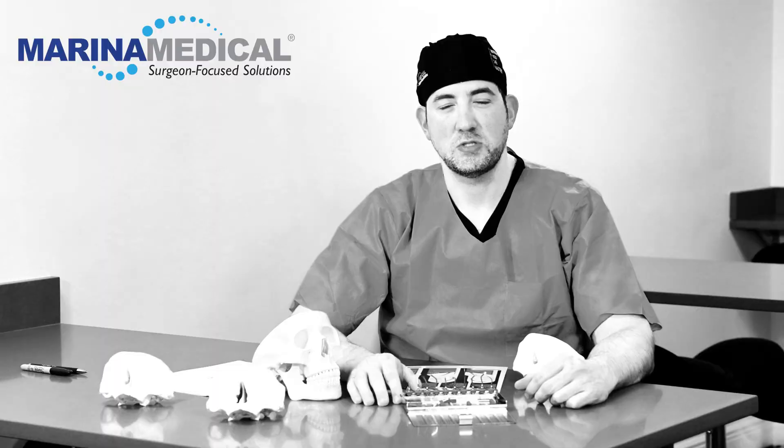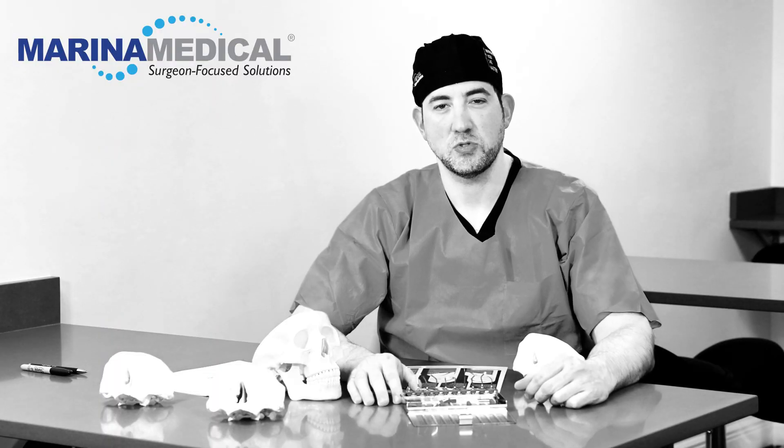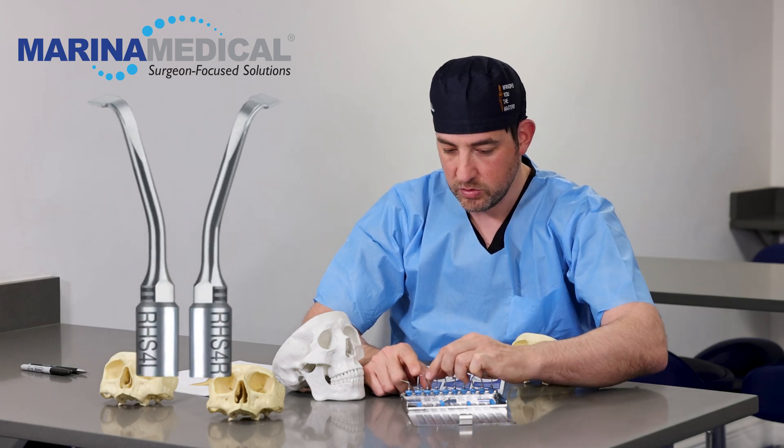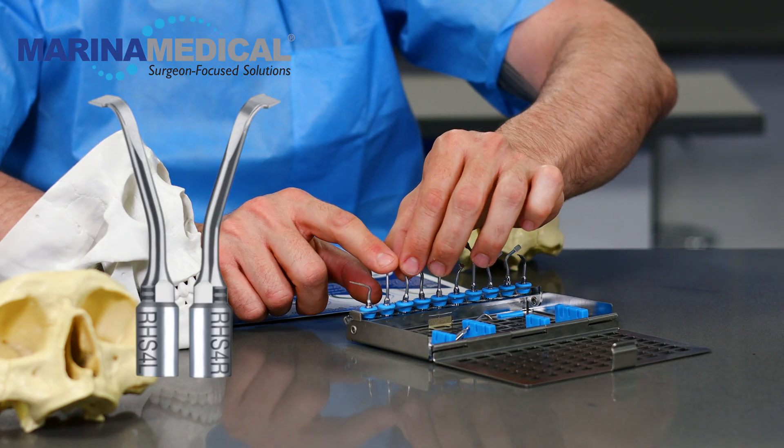Hello, my name is Dr. Itam Weiss. Today I would like to talk to you about different tips of the piezo machine. What we have right here is called the lateral saws. They have a right and left, as you can see here.